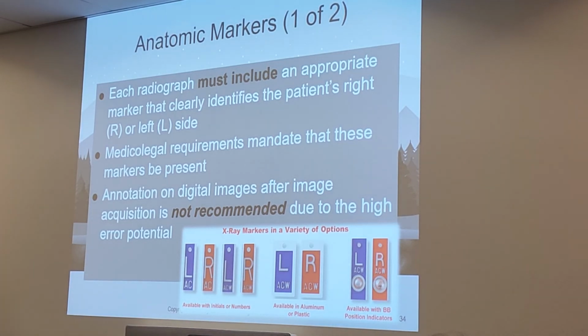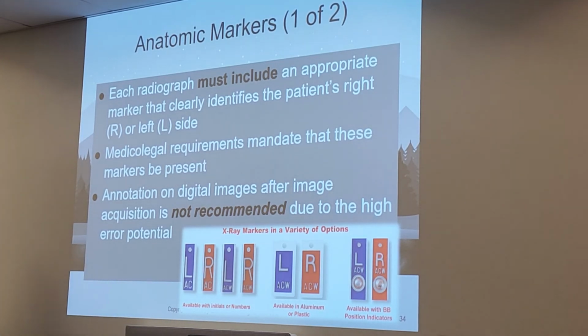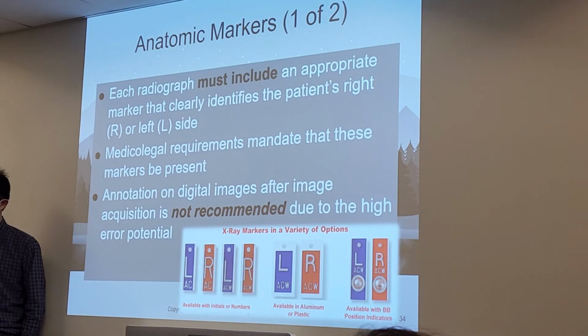Annotations, putting the marker on digitally after you've taken the image, is not recommended because it becomes very easy to put the wrong letter on the wrong side.